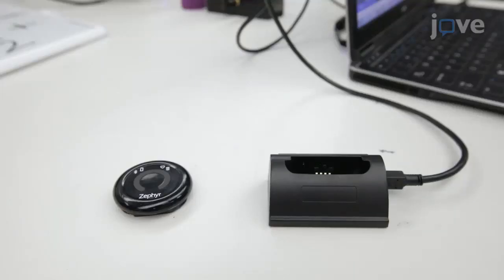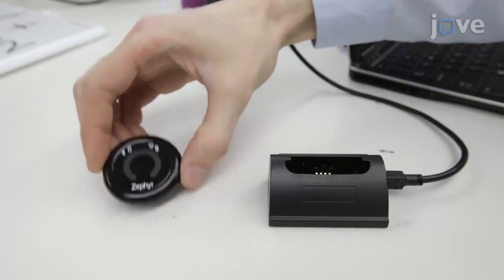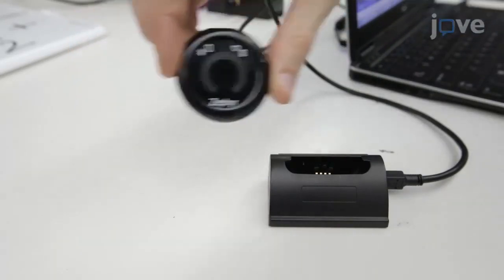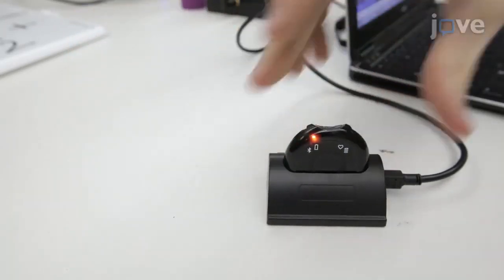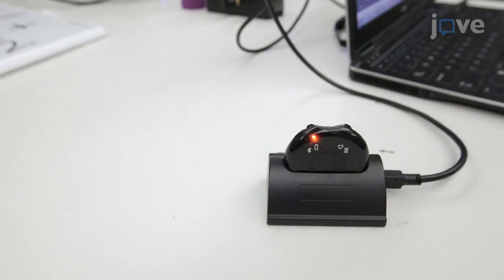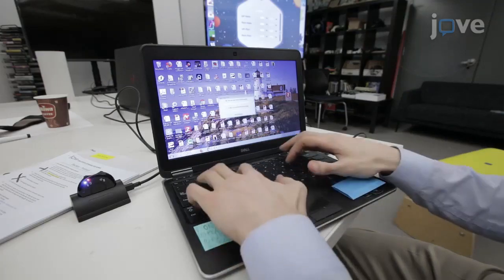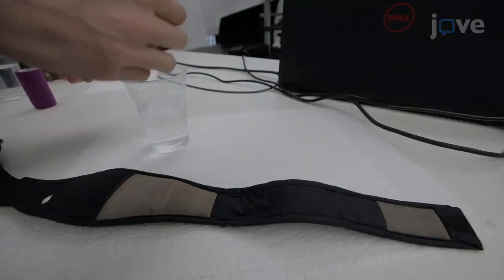To equip the youth subjects with cerebral palsy with a heart rate monitor, first plug a fully charged Bluetooth module into the data computer via the charge cradle and open the config tool. Use a wet hand to moisten the conductive areas on the heart rate monitor.